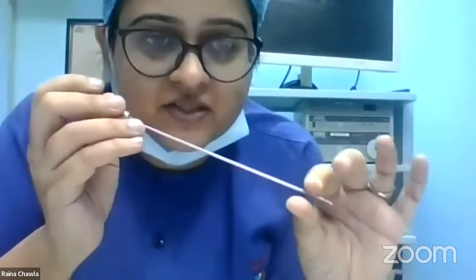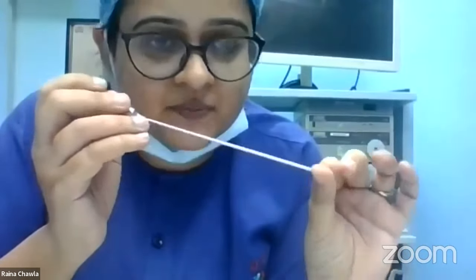Yes, ma'am. Better. Palmer's point is an area which is usually safe, usually adhesion free, if the patient has had previous surgeries. It is a point in the left upper abdomen. Okay, so that point can also be used to introduce the Veress needle and create pneumoperitoneum. So once we've created pneumoperitoneum, so this is the cannula. I'll just show you.